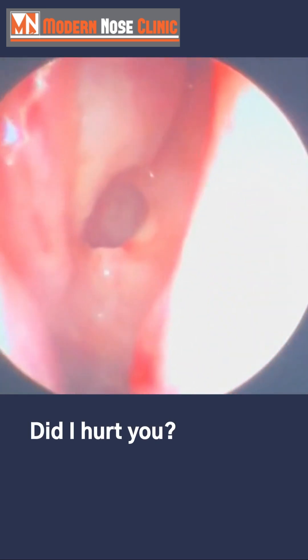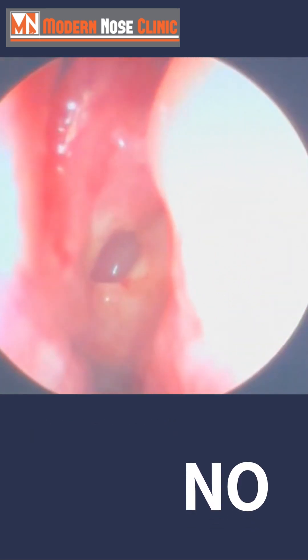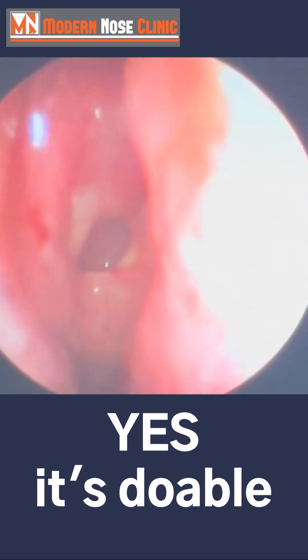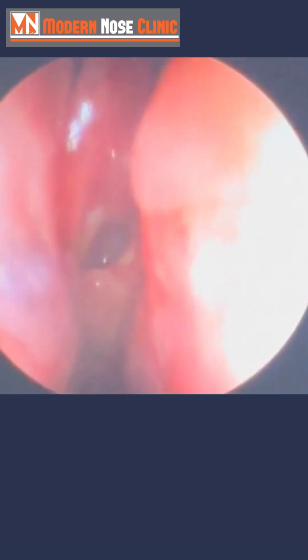Did I hurt you when I did that? No. And so what would you tell a person worrying whether or not they could do this in the clinic? Would you say it's okay, it's doable? Yes, it's doable. She says it's doable with a smile on her face. Thank you for that.